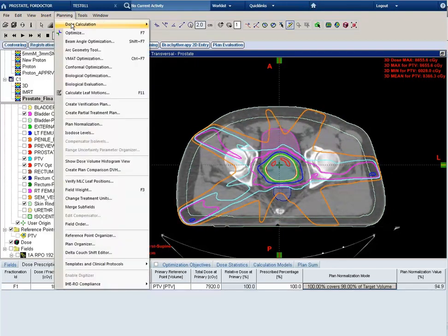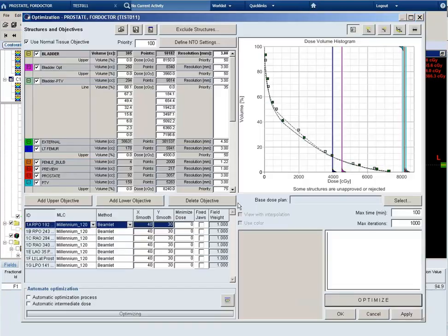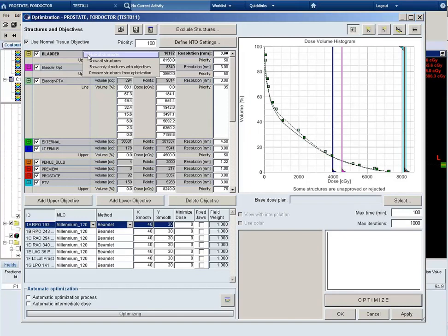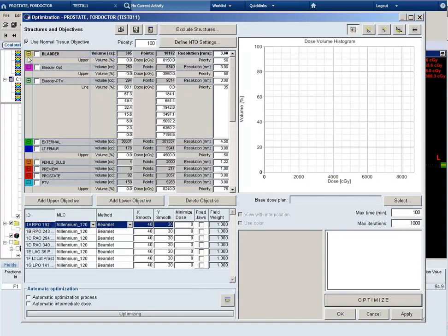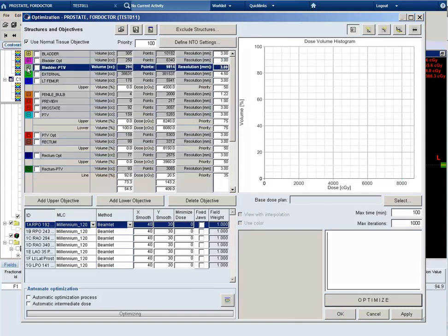So let's go to planning and optimize and change some priorities here. I'll select start again and say OK. And once I'm in the optimizer, I'm going to transfer the constraints from the PTV to the PTV opt.